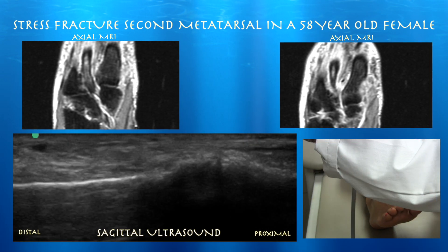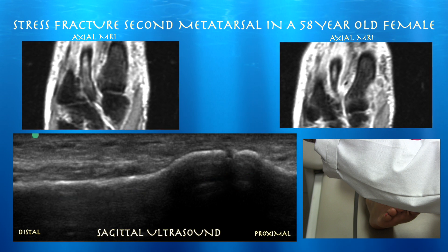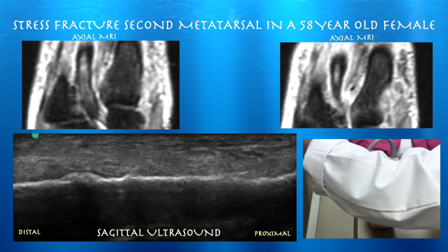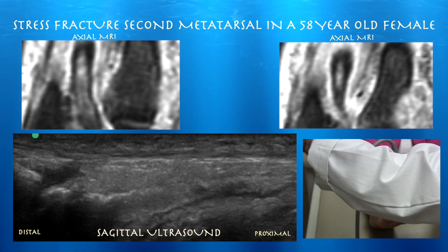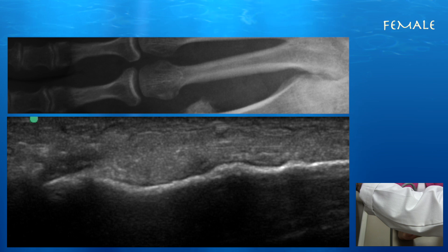Here we are again going distally to the left. The proximal part of the second metatarsal looks fairly well preserved. You can see that callus formation — a little bump in the distal third of the diaphysis — from a healing stress fracture. We can then follow that all the way to the MTP joint. This is a good case where ultrasound is quite sensitive and can find callus where it was not seen on x-ray. Ultrasound can be useful clinically to follow the fracture and see how it's healing and remodeling.